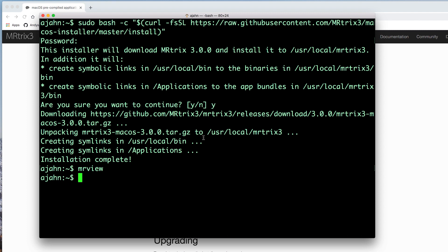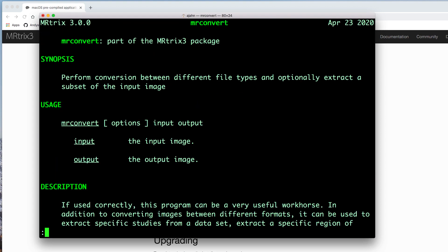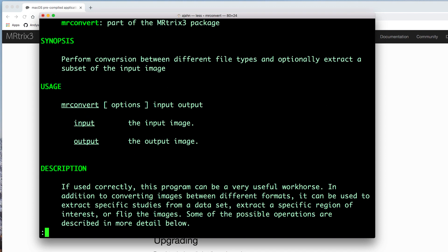Try also typing one of the commands from the library, such as MR-Convert, and press enter. If MR-TRIX has been installed correctly, you should see the help page printed by default when no arguments are passed to the command.